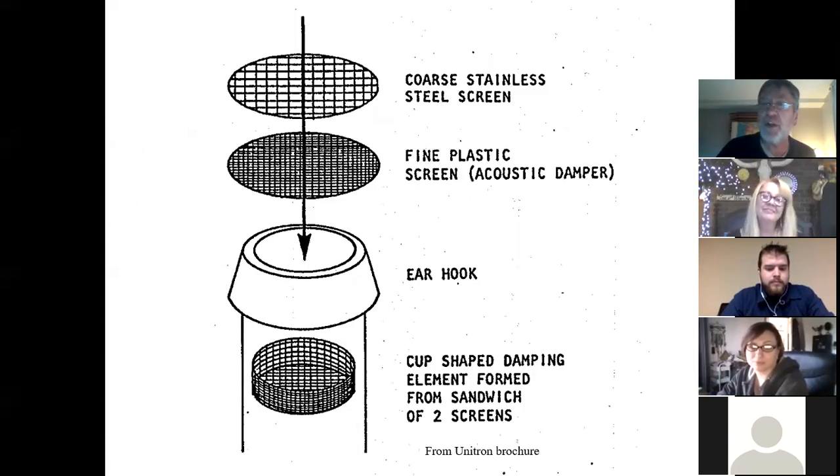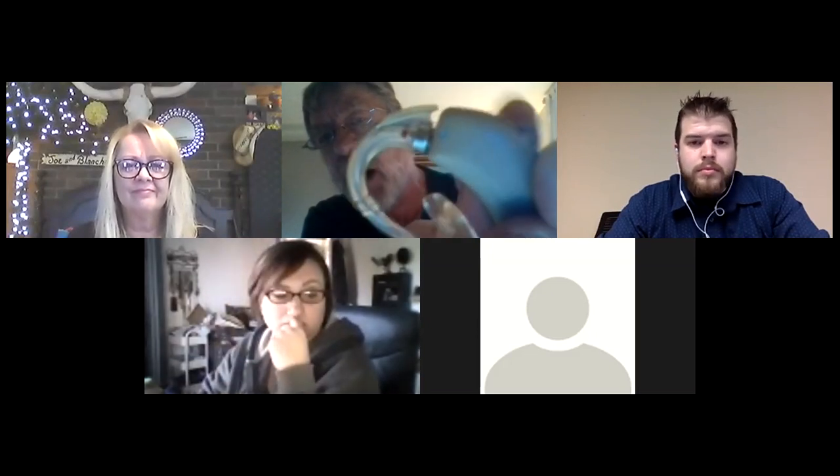So what were the filters? They were screens. And if you have a lot of wind blowing through a screen, you're going to hear, okay, screens provide resistance. And resistance is not opposition due to mass, and resistance is not opposition due to stiffness. Resistance in any object is equal for all frequencies. So they would put little screens in the hearing aid, and the screen in the hearing aid would look something like this little red, I don't know if you can see that guy here, there's a little red dot. See that in the hook? Right in there, little red dot.